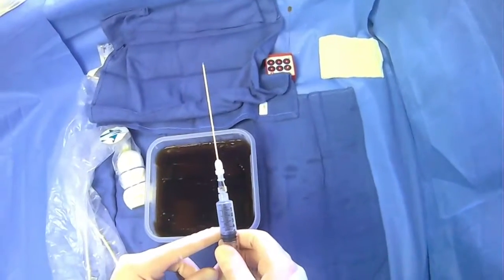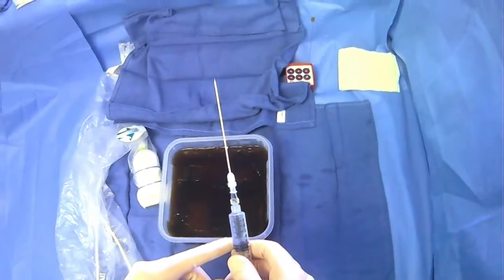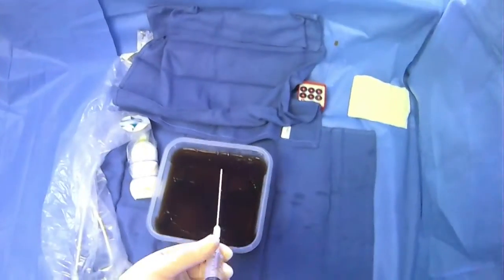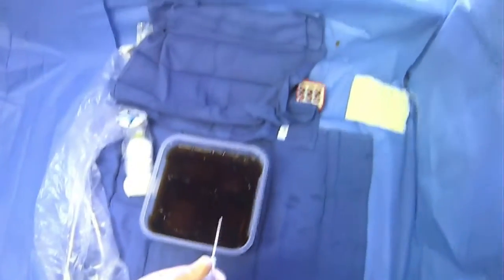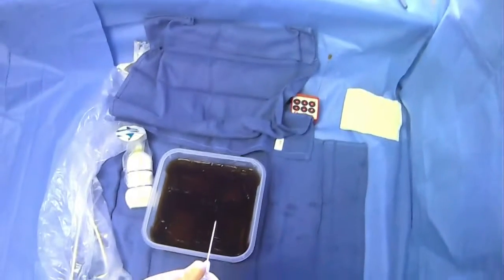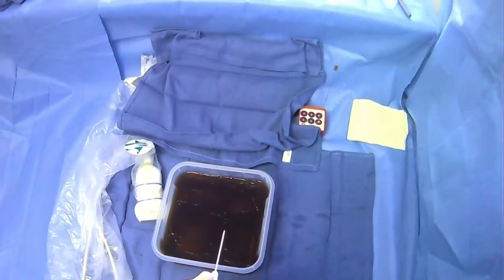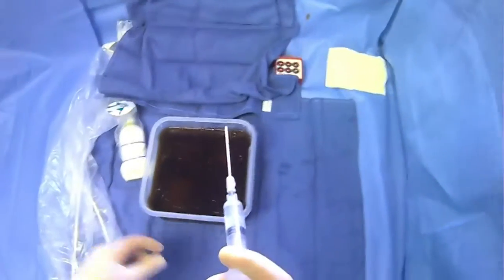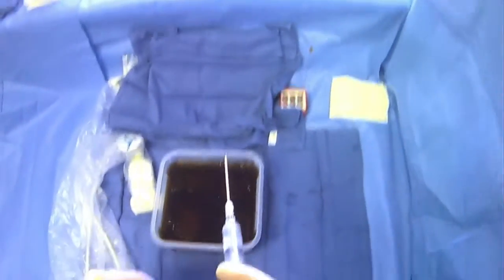Let's say we have it on a syringe filled with lidocaine. The advantage of this is that we can give lidocaine deeper, up until we drain the ascites, to numb up the patient. It's important to be mindful of your hand positioning because you're going to be doing a few different things.